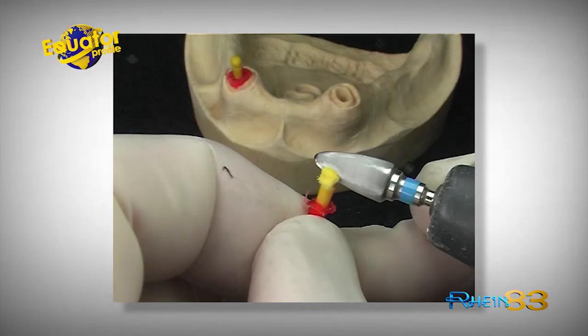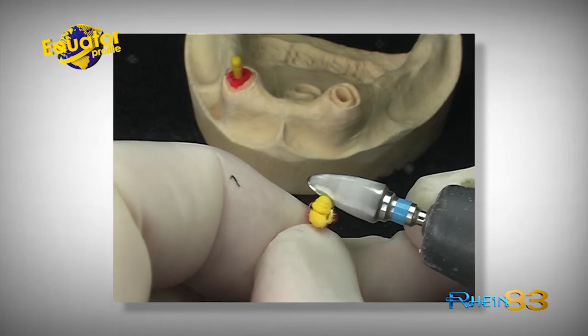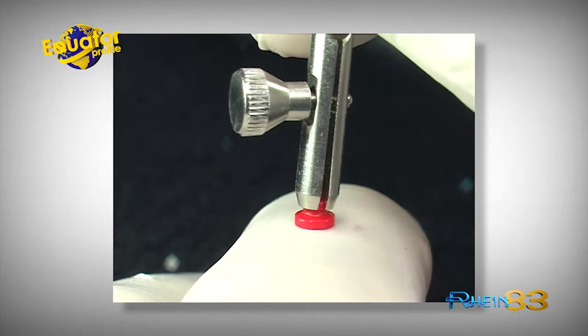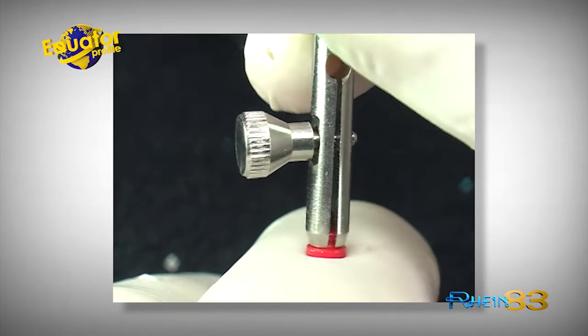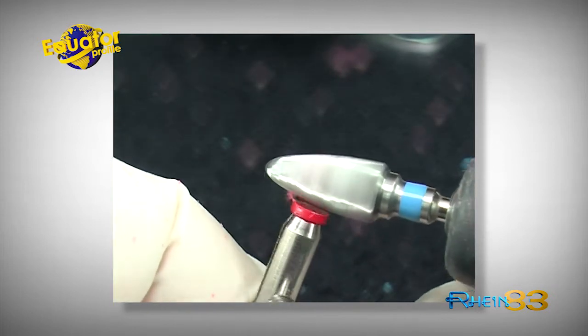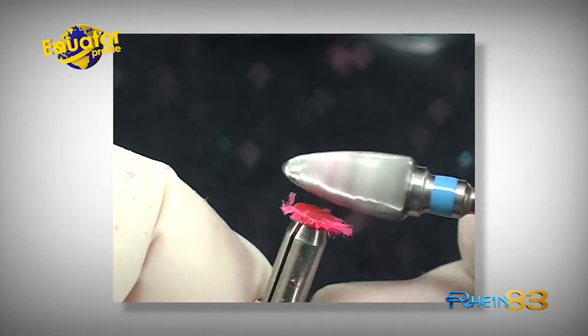Reduce, if necessary, the base of the castable OT Equator Attachment. In this way, we will try to save vertical dimension for better aesthetic results, without losing retention degree levels.